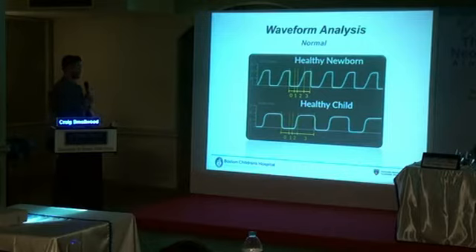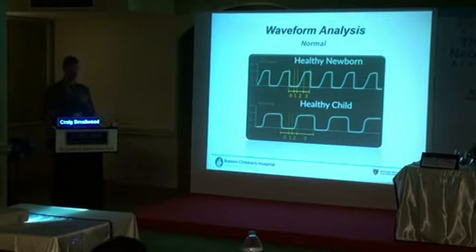You will note in some of the literature, it'll start with 1, 2, 3, 4. It doesn't really matter. The reason I prefer 0, 1, 2, 3 is because 0 is really inspiration, and then you start counting once exhalation begins. That's basically what is indicated by these little dashed lines. So here, patient breathes in, breath goes in. There's obviously no CO2 in that gas, hopefully not at least. And then you begin to exhale. There's hardly any or no CO2 in the conducting airways.